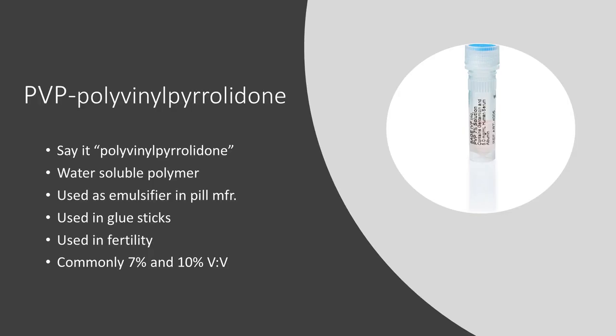At any rate, we've been using PVP since the beginning of ICSI in 1992, and during my master's program, I was given the task of trying to determine other alternatives to PVP and did ICSI for about a year without PVP. It didn't affect my fertilization rate. It didn't make embryos look better. It just made ICSI harder to do. So I've gone back to using PVP for all my ICSI and still do that today.